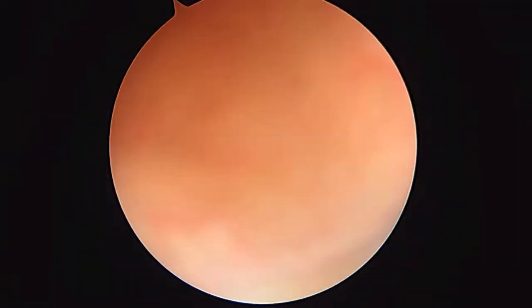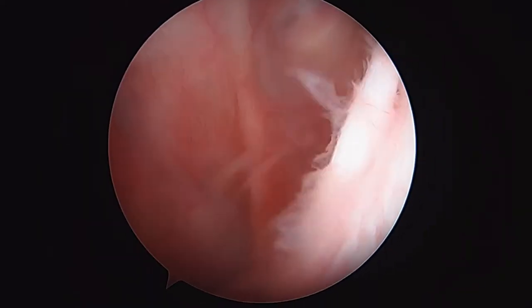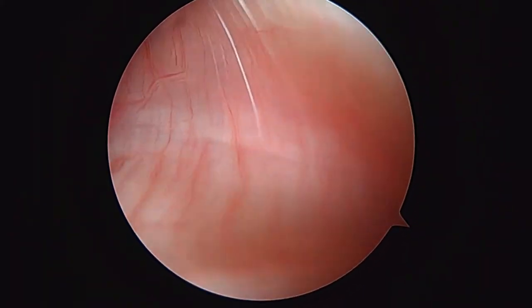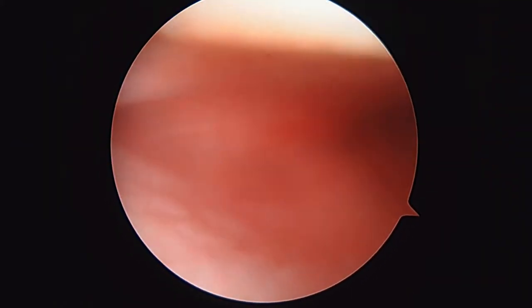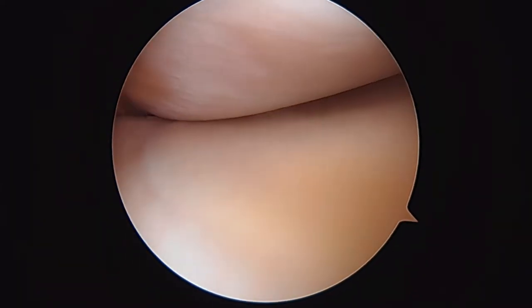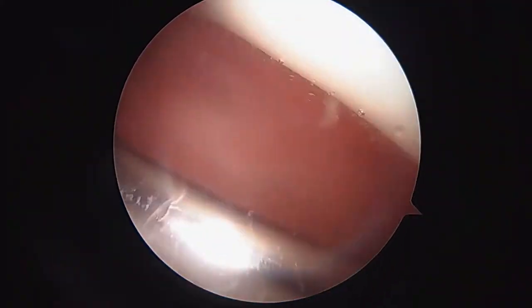Not much in the way of articular damage or degenerative change. As we look down here in the lateral gutter, that looks pretty good all the way back there. That's actually the outer portion of the lateral meniscus right there. We'll come back up and get back in the suprapatellar pouch.